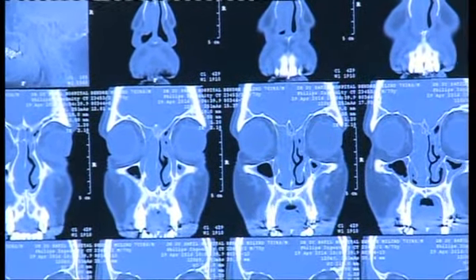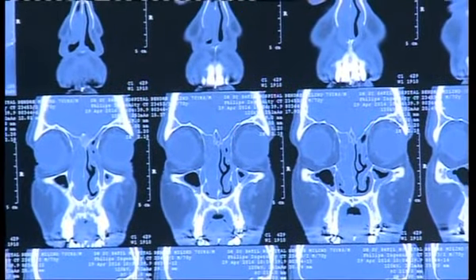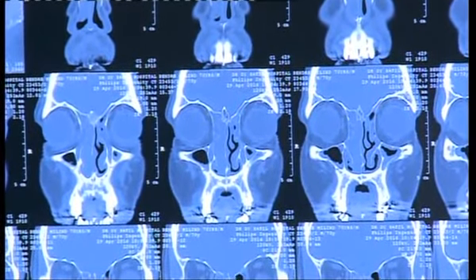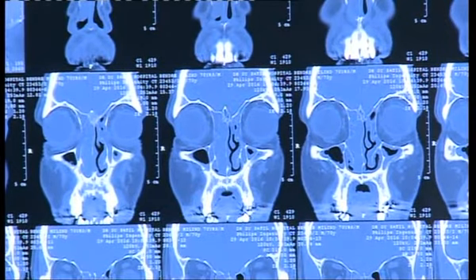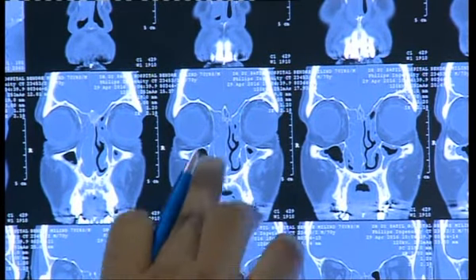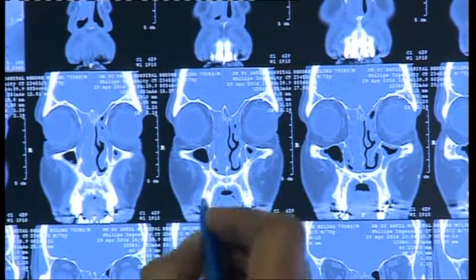Can you see, Satish? Sorry to interrupt. Are the skull base levels different on two sides in this case? No, the picture is looking tilted. You see the difference on two sides. The shot was taken when the patient was a little tilted. But your question is right, sometimes you may find an asymmetrical skull base or roof of the ethmoid.